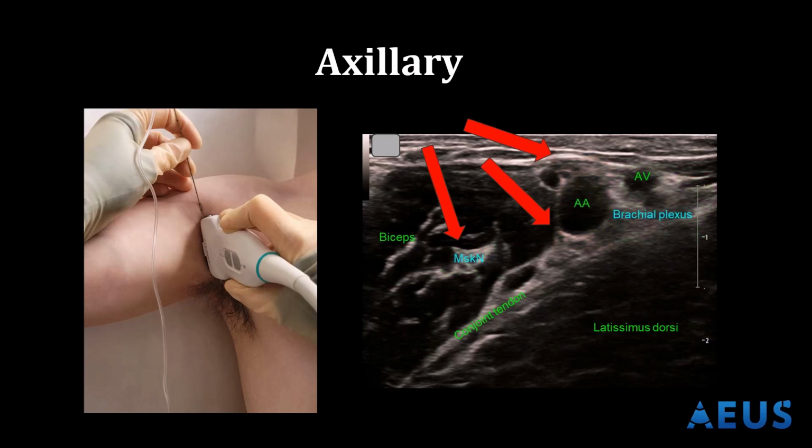Approaching laterally, 3 injections are needed. The first target is below the axillary artery, where 8 cc's are injected. Withdrawing the needle and adjusting to a more superficial approach, the next target is the anterior-most part of the brachial plexus sheath, where an additional 8 cc's of anesthetic are deposited. Finally, the last target is the solitary musculocutaneous nerve, where the final 4 cc's of anesthetic are injected.